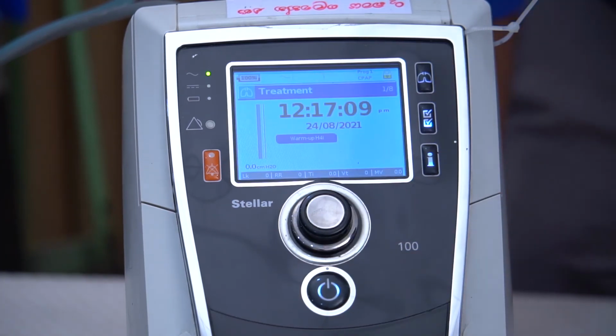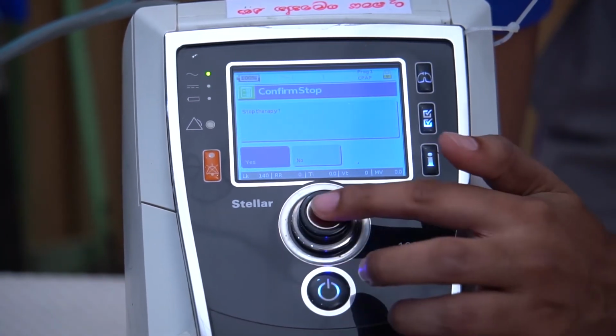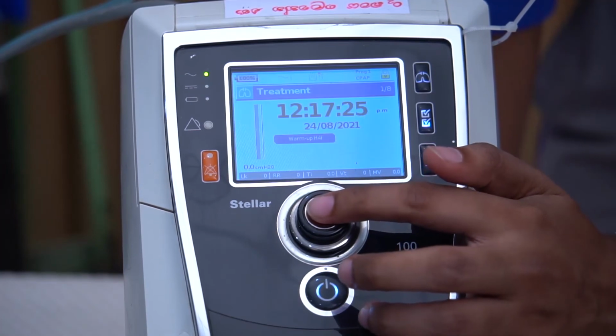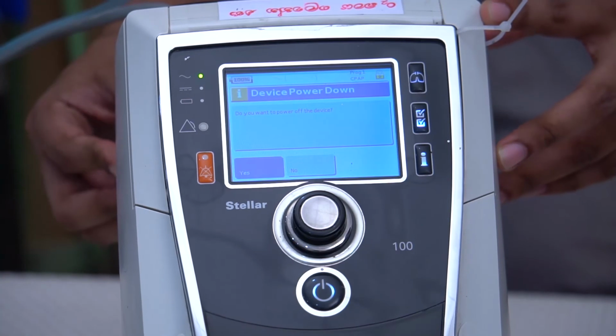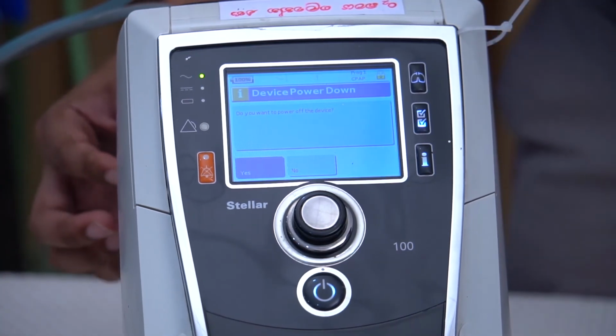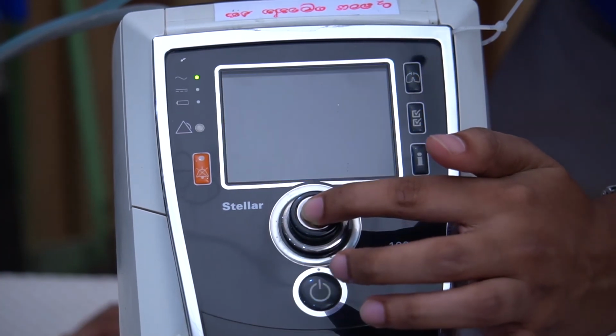How to switch off the unit? You need to stop ventilation before switching off the unit. So first press the on-off button on the upper surface and stop the ventilation. Then press the switch on the rear surface. Then a warning message will appear on the main screen, and select yes for permanent switch off.